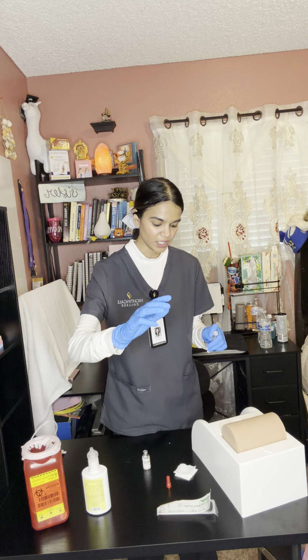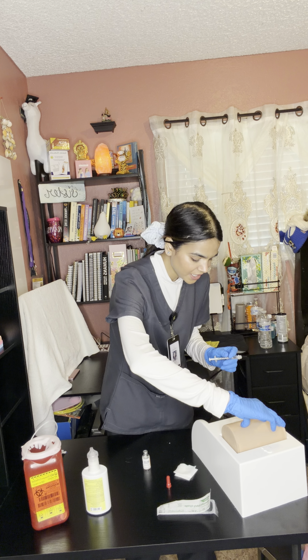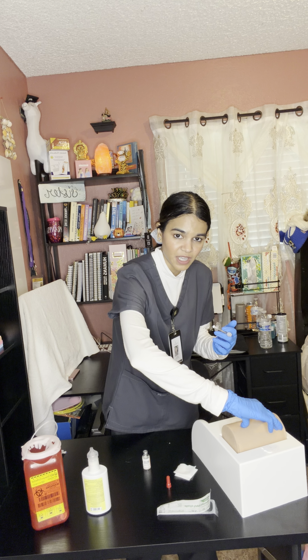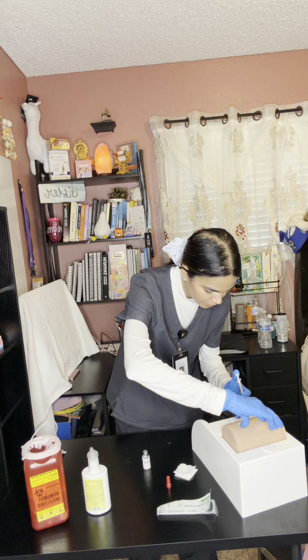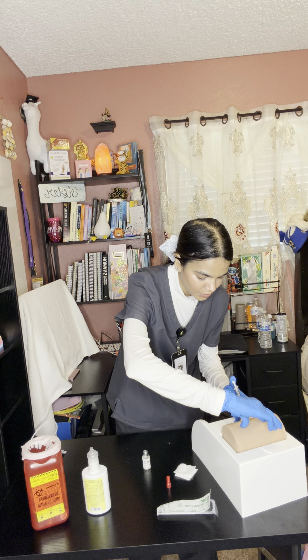I will then use my non-dominant hand and hold the skin tightly. We are going to inject the medication at a 5 to 15 degree angle, and we will go as deep as 3 millimeters. Then I will inject the medication into the skin.